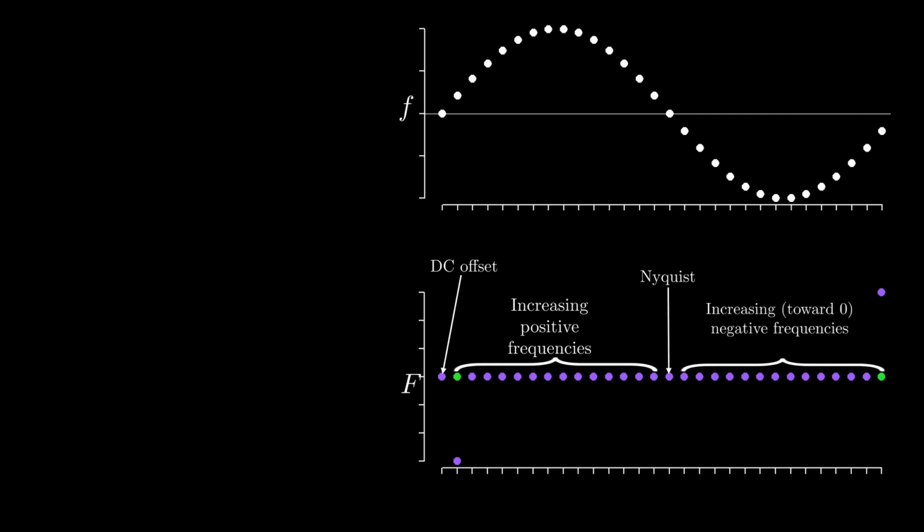If you remember our Fourier solution for the sine from earlier, it looked like this. When you take FFTs, it's like taking the negative part of the frequency axis and sticking it on the end of the positive side, where the end is the Nyquist frequency.